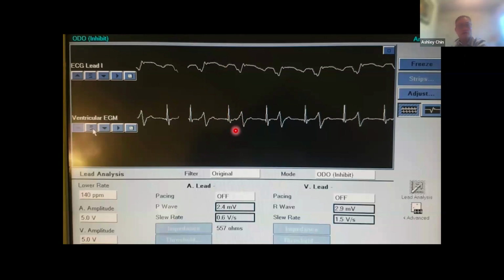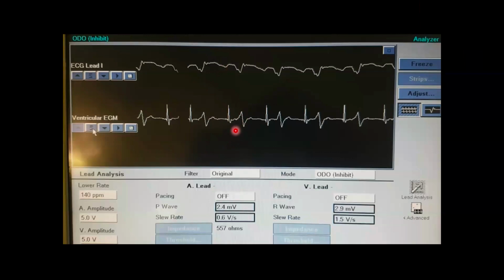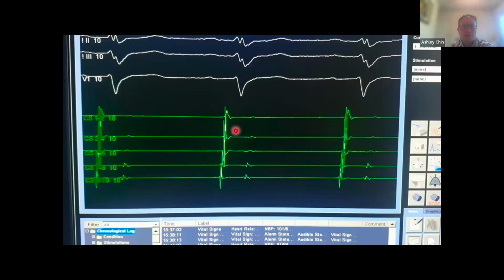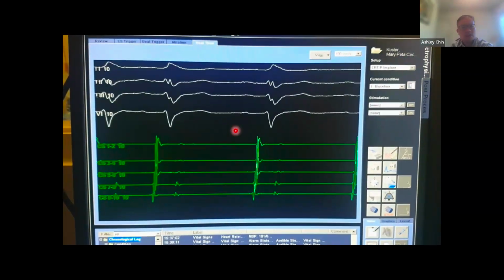If I'm in the ventricle, I'm too ventricular. I'm not going to find it there. And if the atrium is too big with no V's, then I'm too much in the atrium. So you can use the signals that you have to help you get into the coronary sinus. I do know some individuals that don't use signals, and you can probe with just the decapolar catheter, which you can do. But I find if you've got the signals, it just gives you free added information to get into there. If you've got an EP recording system, this is what you'll see.